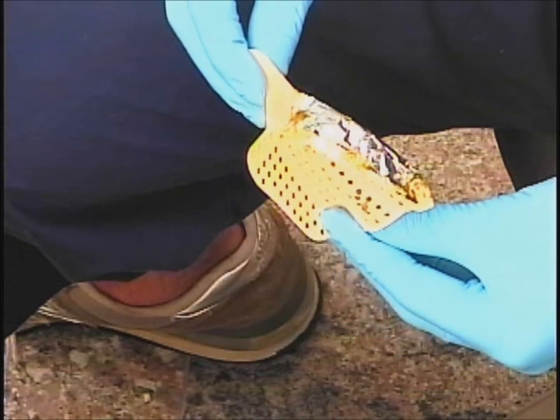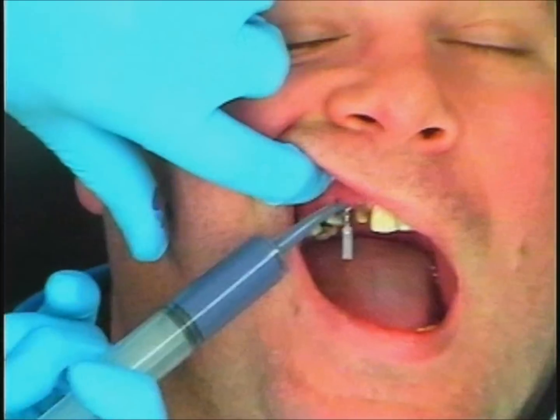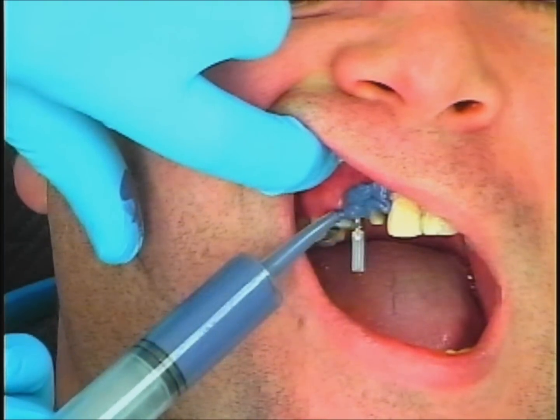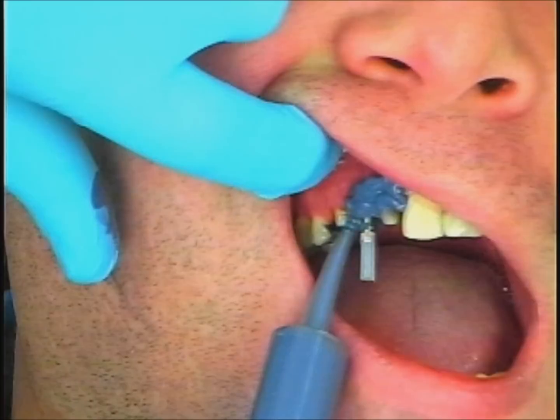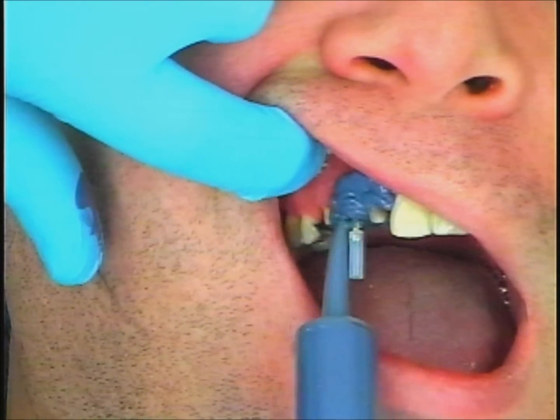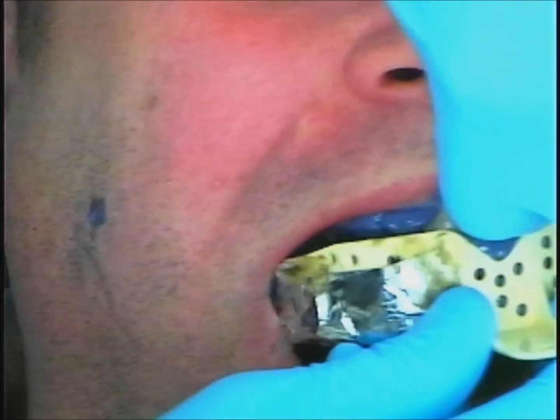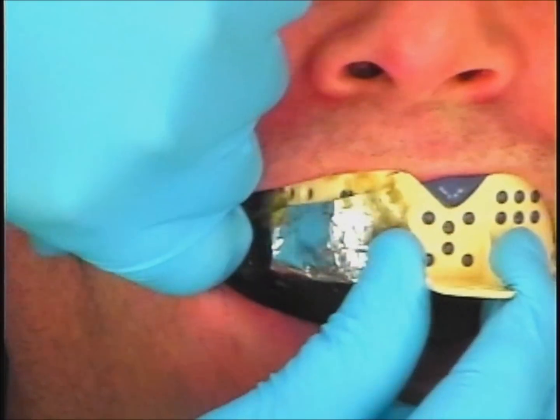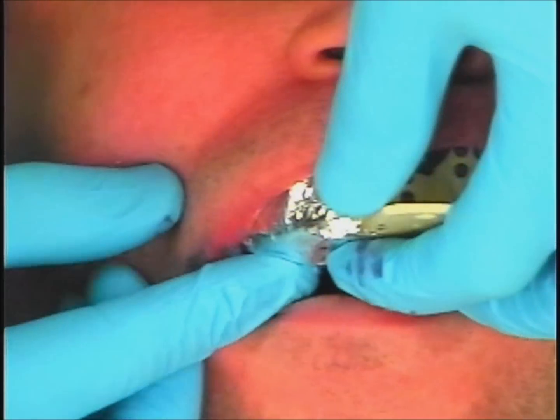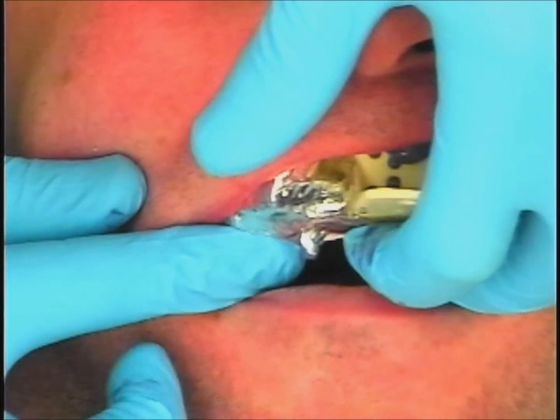And you can see my finished product here, so we're ready to go. I'm going to have my syringe of impression material that I am placing all around the implant — I want to make sure I get all of that detail. At the same time, I have my tray getting filled with impression material. I practiced placing that in a few times. I'm going to now insert the tray, remembering where that plastic tube is going to stick out. And as you'll see here, it pokes right through. Terrific.